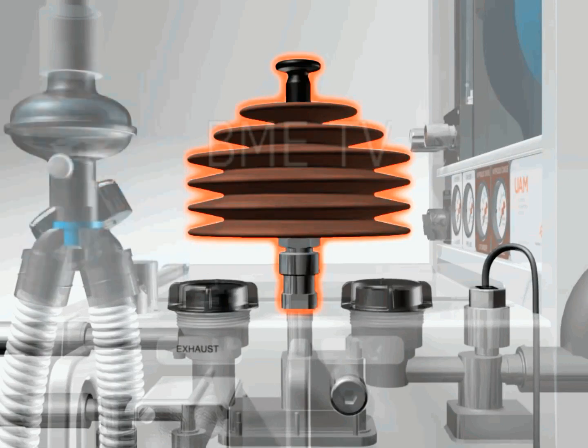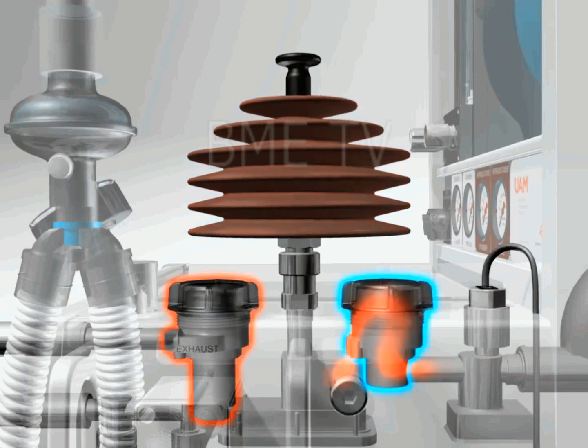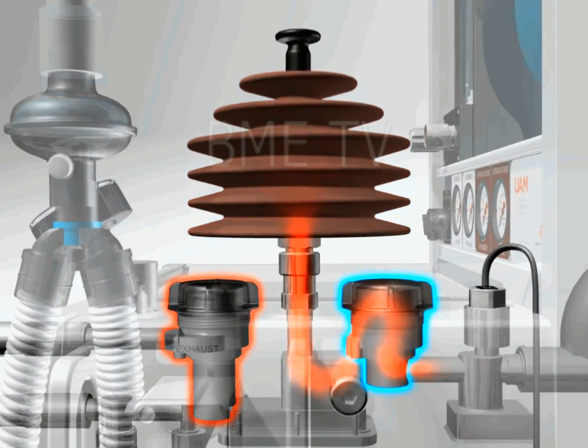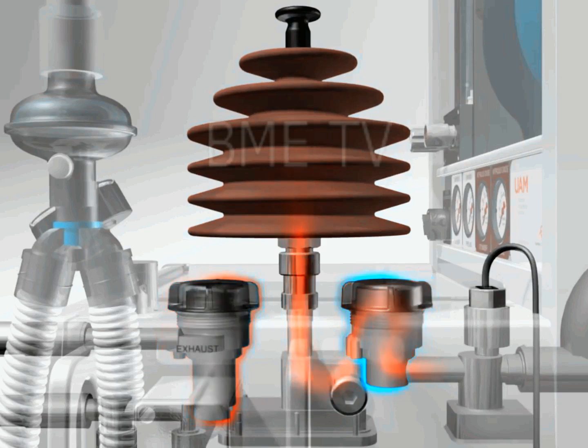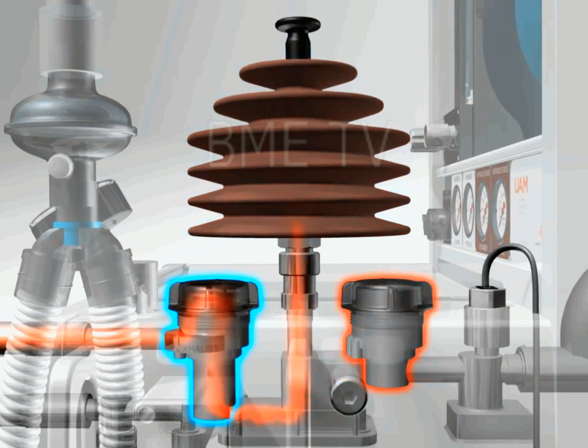The second is draw-over vaporizers. The draw-over vaporizer is driven by negative pressure developed by the patient and must therefore have a low resistance to gas flow. Its performance depends on the minute volume of the patient. Its output drops with increasing minute ventilation. The design of the draw-over vaporizer is much simpler. In general, it is a simple glass reservoir mounted in the breathing attachment.